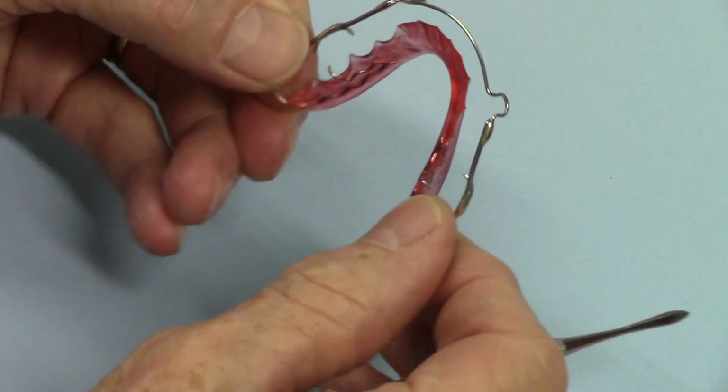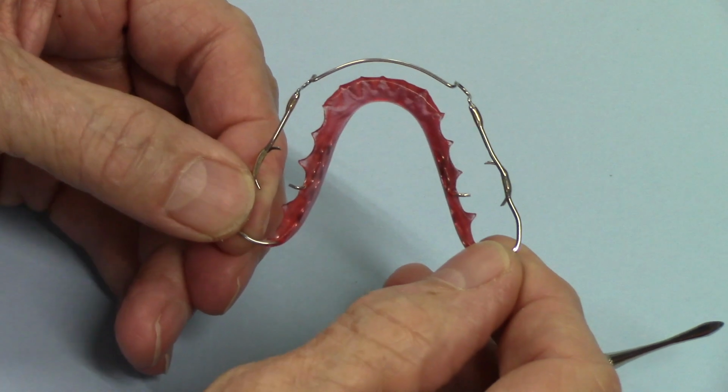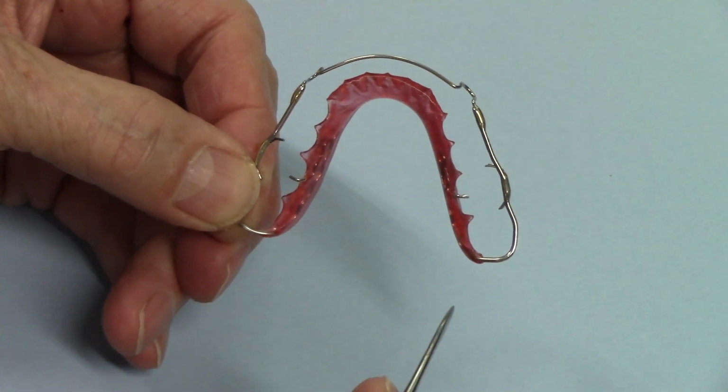Okay, so there's a couple of designs of wraparound retainers that do not require the auxiliary support wires.